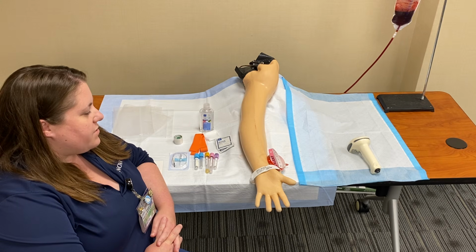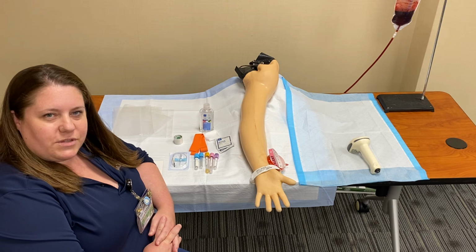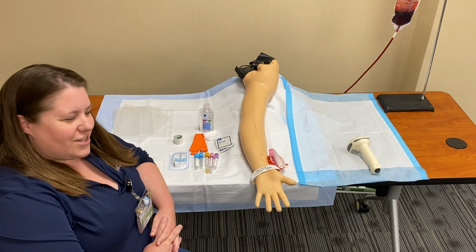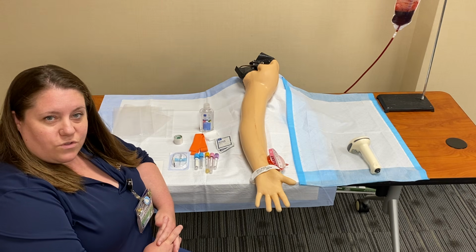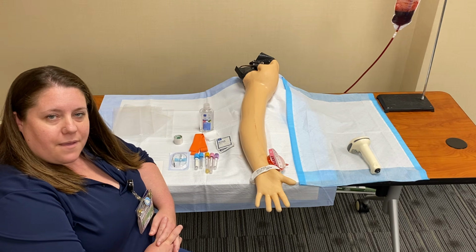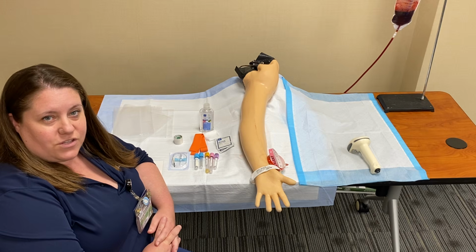So the nurse will come up to me and say, we have a patient, her name is Jean Gray. She needs some blood work done. Do you have some time to do that? So I'll say, sure, no problem. What tests would you like me to run? And the nurse has told me a PT, BMP, CBC, and type and screen.